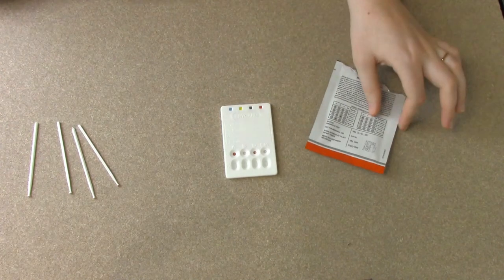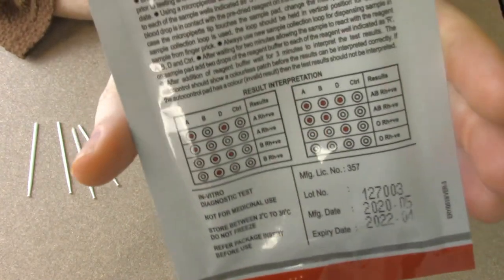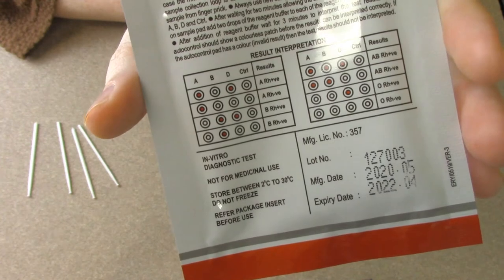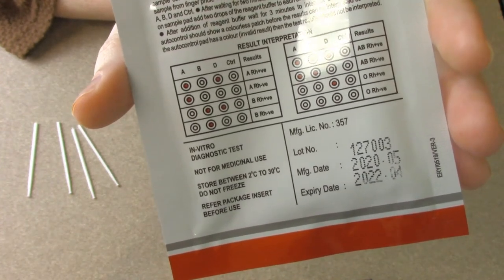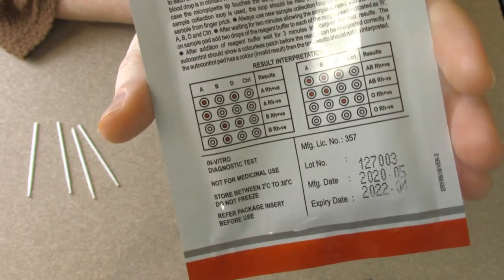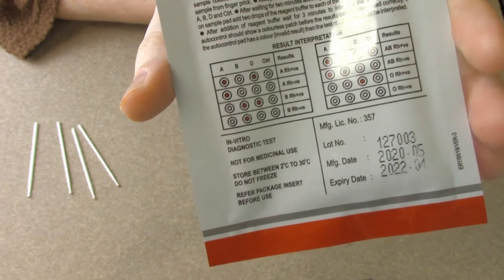So if you look at this card here, if we're reading and trying to interpret my results, you see that the first one there, A and D have remained red and the B and control have become clear. So I have A positive blood. Now I knew ahead of time that I did have A positive blood and I'm really confident that this result is accurate.